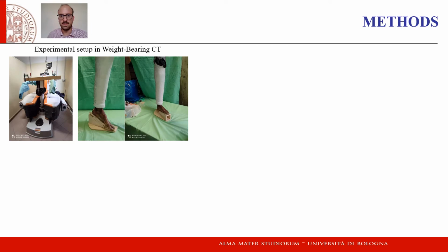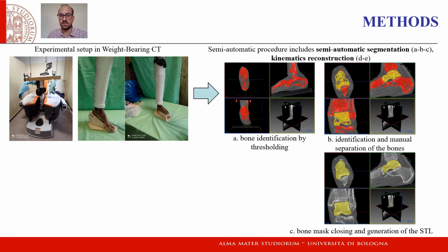The foot is scanned in weight-bearing CT in 15 different configurations, varying dorsiplantar flexion and prono-supination angle among wooden wedges to map all the range of the foot motion. The kinematics reconstruction includes semi-automatic segmentation and automatic registration. The segmentation was carried out in the free software MITK.